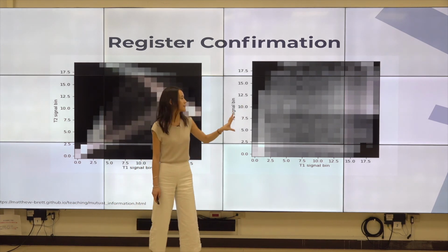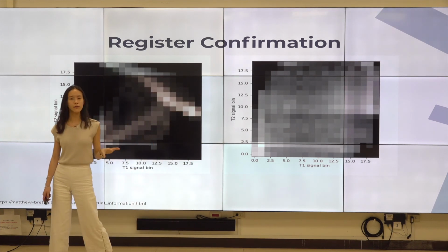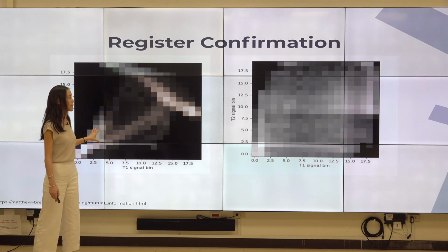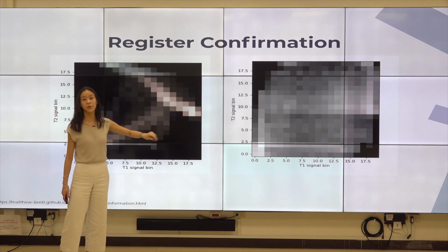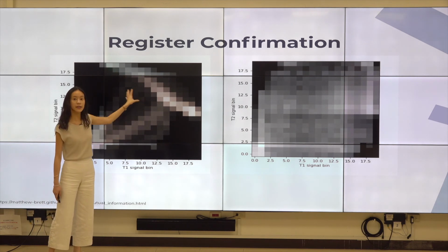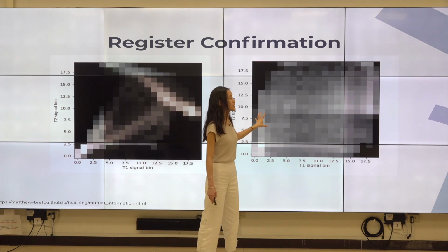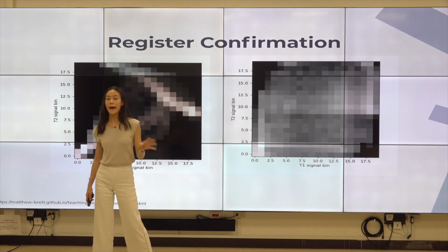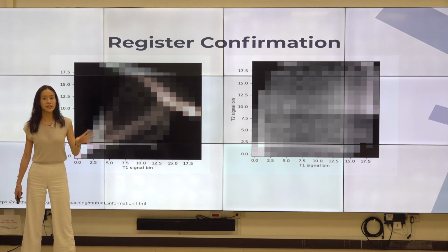You see these different grays, whites and blacks in there, which shows that the image was not as well registered as this image, which is very clear in terms of clarity and where, for example, objects are. If these two images were both apples, what you would see in this case is a massive red area in the middle representing the shape of the apple that you'd be able to recognize, whereas in this situation you may have a little bit of pink on the outside and on both sides of the apple shape, so you're not able to distinctly recognize it as the shape of an apple.